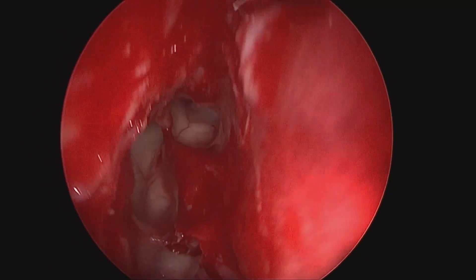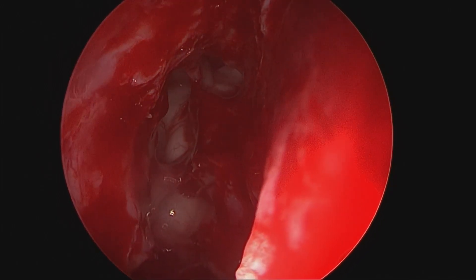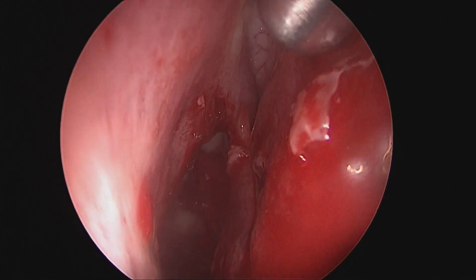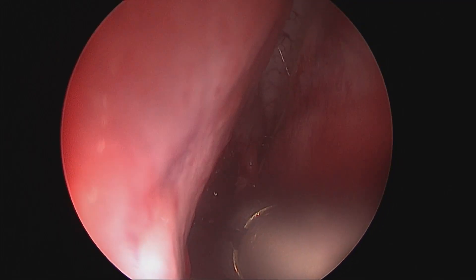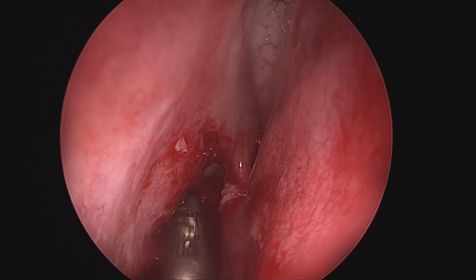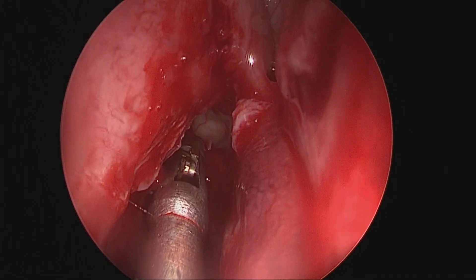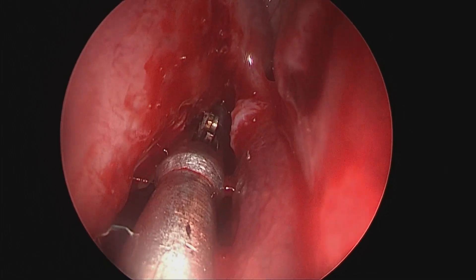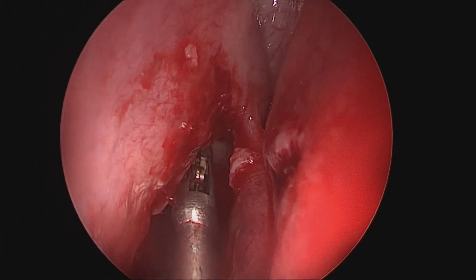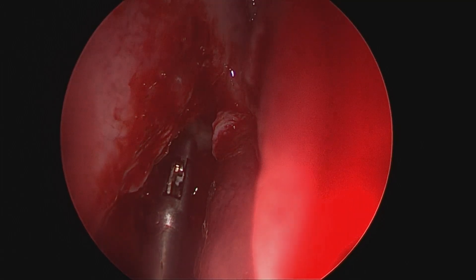This wall attaches to the posterior wall of the agger nasi as it happens in frontal buller cells, and any attempt should be directed only toward the anterior wall of the frontal sinus, not posteriorly. Some portion of the party wall fractured using a curet can now be removed gently using giraffe forceps. The giraffe forceps shaft is placed below the angled endoscope so that vision is not impaired.